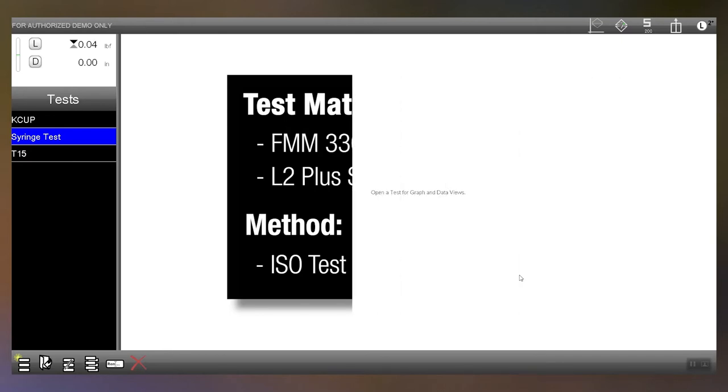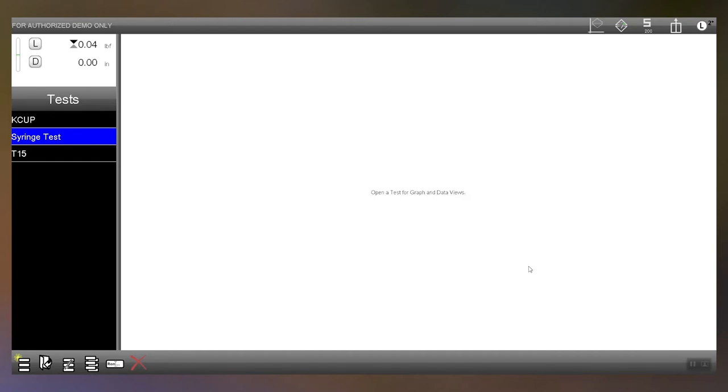So getting started here, you can see I've already created the syringe test so let's go in and look at it real quick.